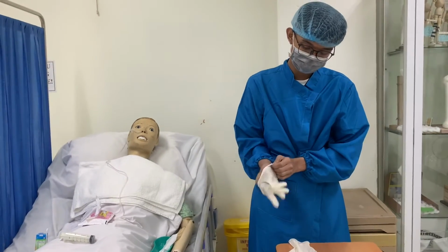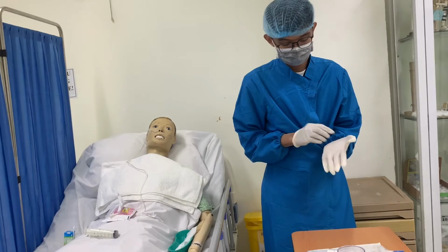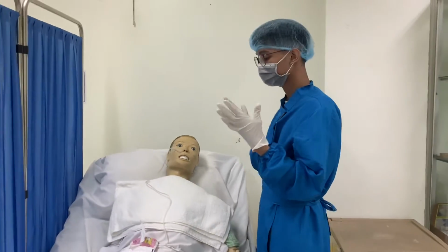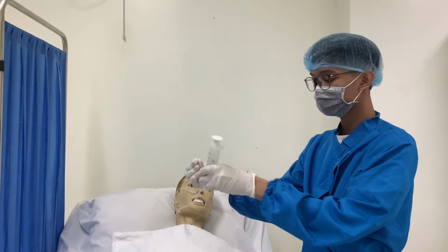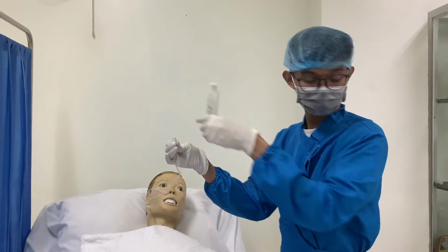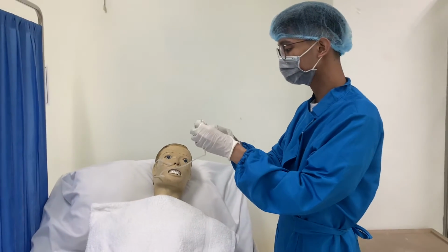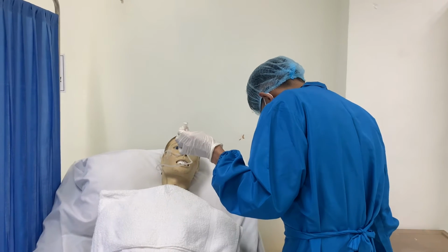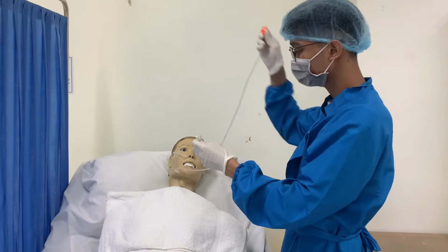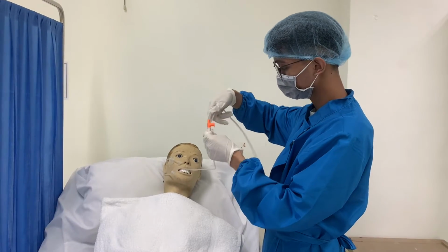Put on gloves. Clamp the tube and remove the syringe. Cap the tube or attach the tube to suction according to the medical order. Measure the length of the exposed tube and reinforce the marking on the tube at the nostril with indelible ink. Ask the patient to turn the head to the side opposite the nostril where the tube is inserted.